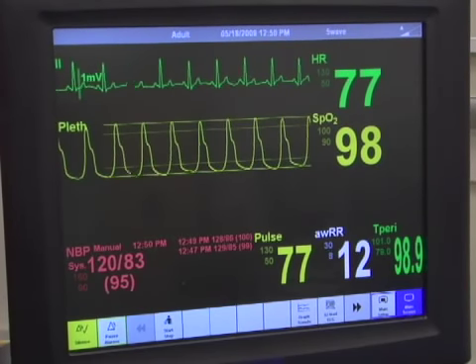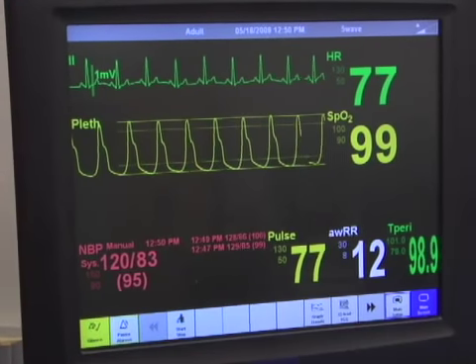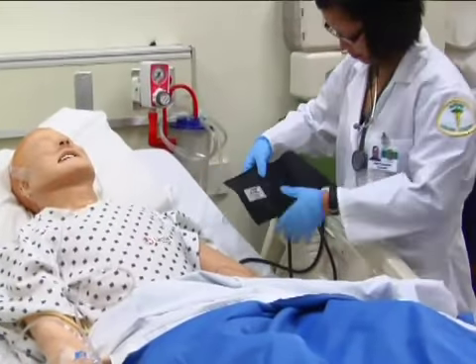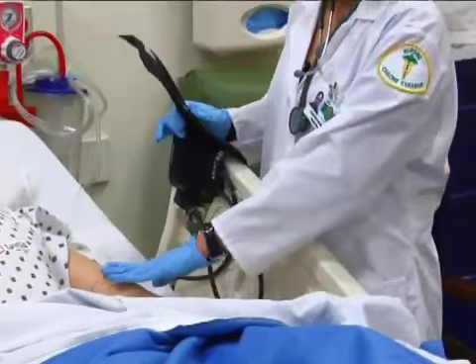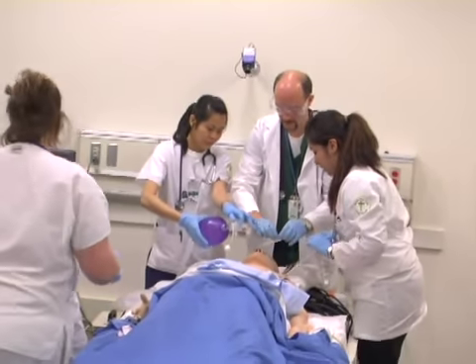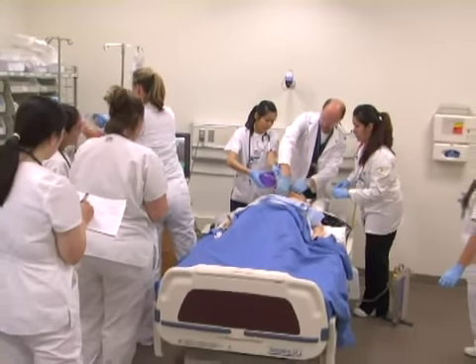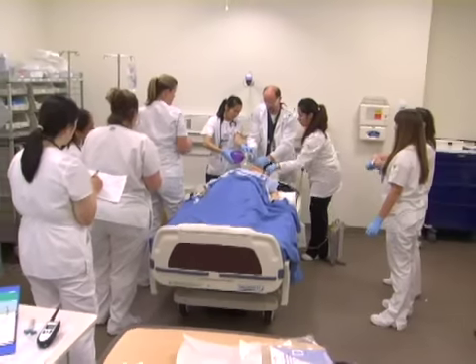Once this is done, you have successfully used and tested the equipment and devices that you will use in real-life situations. You should definitely feel more comfortable during your first time with a real patient. In seeing what this program has to offer, we hope you too value what the Sim Lab has to offer in your medical education. We look forward to working with you with this unique learning experience.